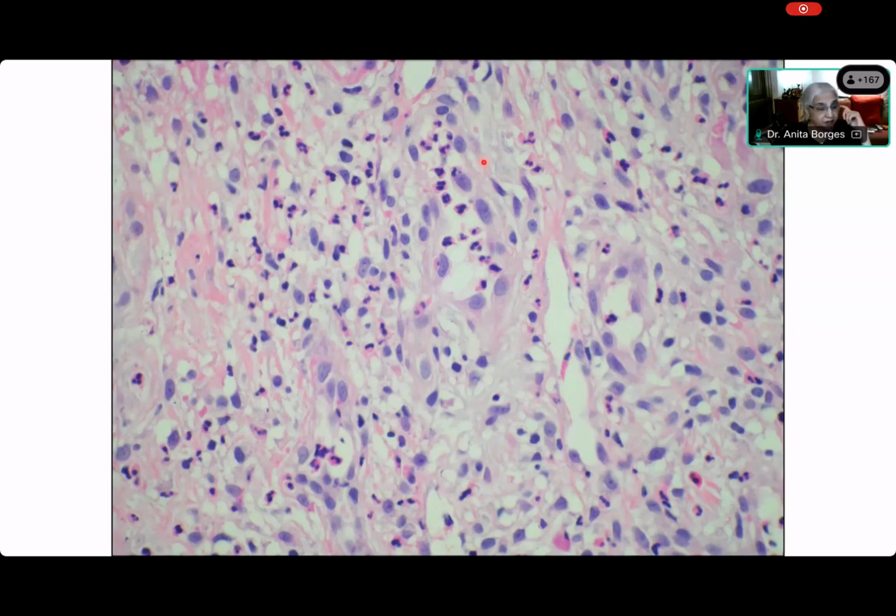They're all sitting in the lumen over here. Diksha, what is it? Okay. Aditi, what is it? Margination, rolling, adhesion, those phenomena. So now, Kedar, you recognize that this is margination of leukocytes.